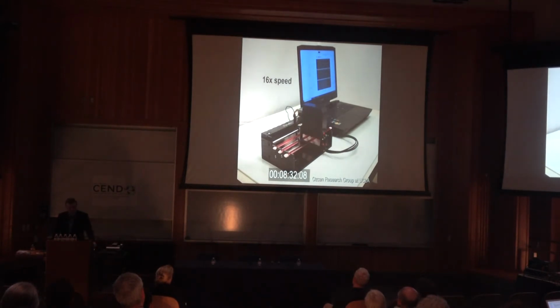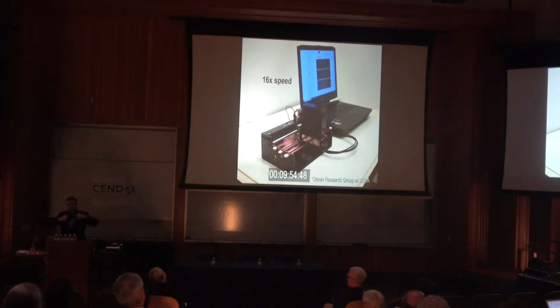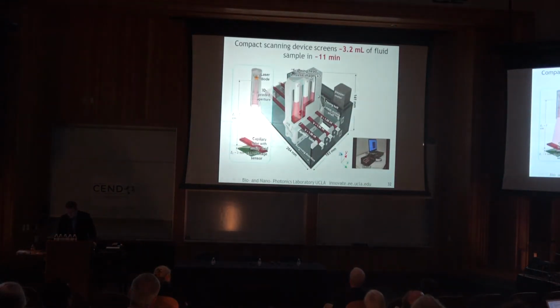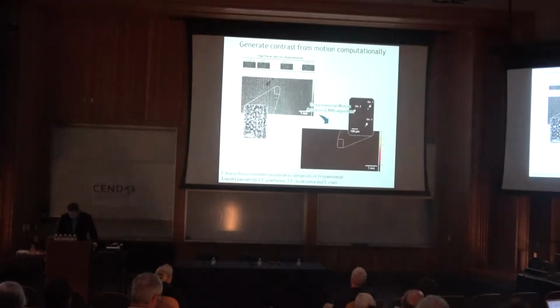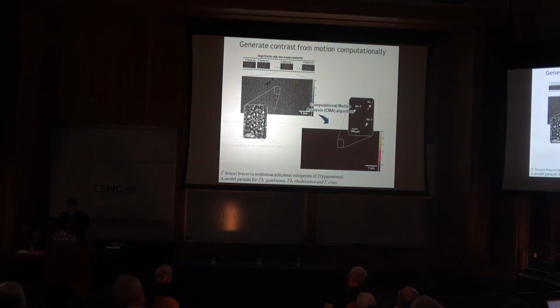We've done some analysis showing that the illumination over those few seconds might heat up the sample and cause some gradient of heat. As a result, we might have false detection because RBCs, red blood cells, and other debris might essentially be moving. So that's why the locomotion of this head is designed in a smart way to not heat up the sample. So everything that is moving there is really the true trypanosomes. And after the acquisition, in fact during this entire 11 minutes, a laptop is processing these images as they come, which means it's doing the parasite detection.